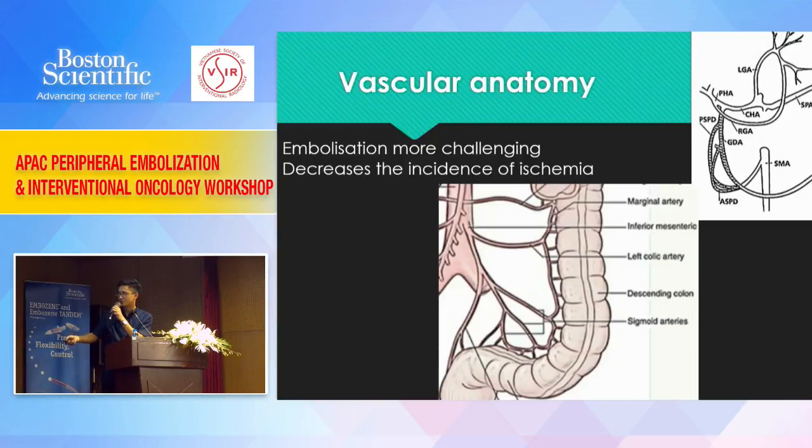The marginal arteries we should preserve, and the perforating arteries we can occlude to stop bleeding without any complication of ischemia.